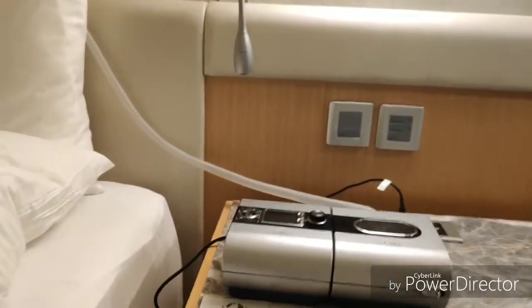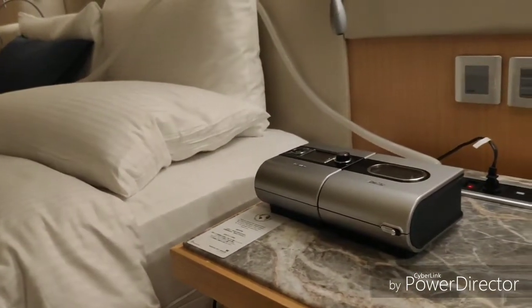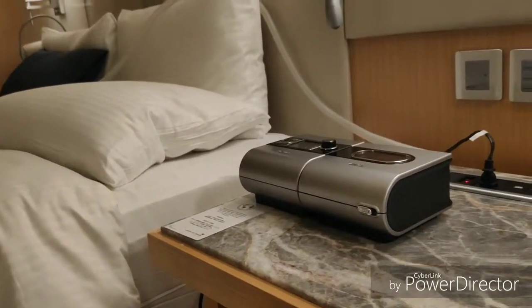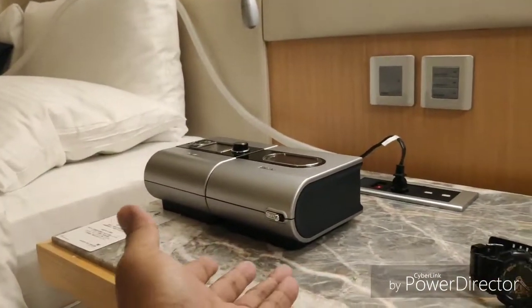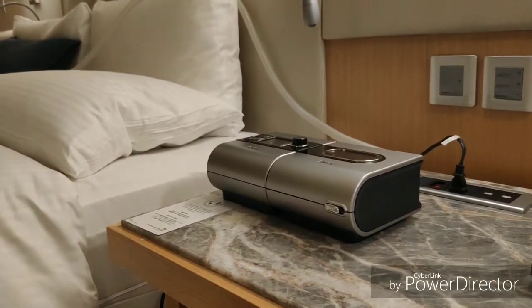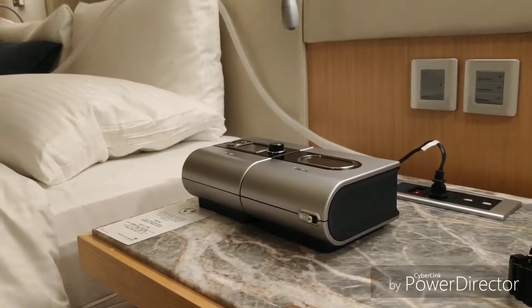Hi, this is Cam, your friendly sleep tech. Alright, let's go towards the location of the CPAP. When you have a CPAP, make sure that it's close by the bed and that it's on a stable, hard surface, not anything soft like blanket or pillows or even paper, for instance, the top of magazines. Because even though the bottom of the humidifier is protected, you can never tell if there's any short circuit that happens or whatnot. So make sure that wherever you put the CPAP on, it's a sturdy, hard surface.